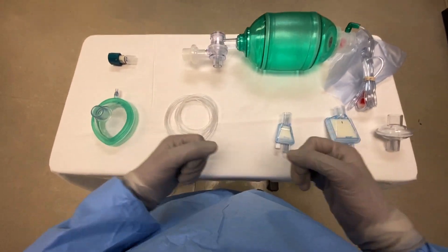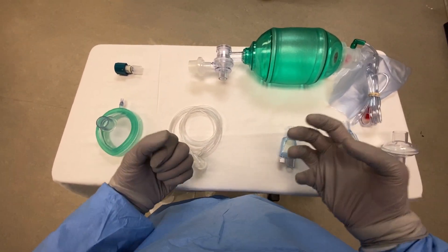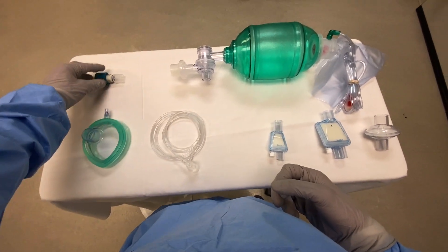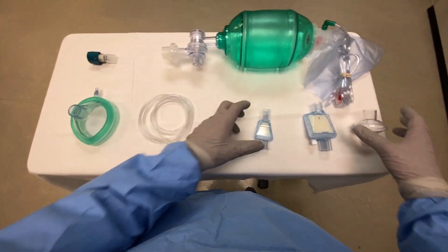We're building a bag valve mask setup intended to decrease the amount of virus in the air. What we need for this is our mask, we need our end tidal CO2 sampler, we need a peep valve, our bag, and we need a viral filter.